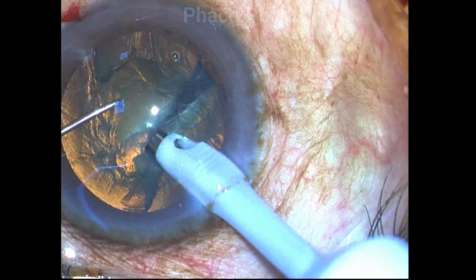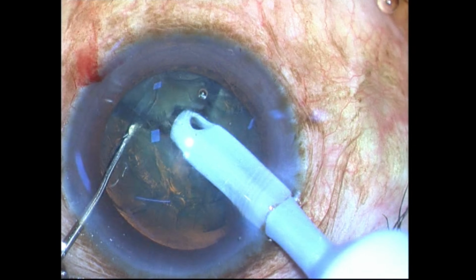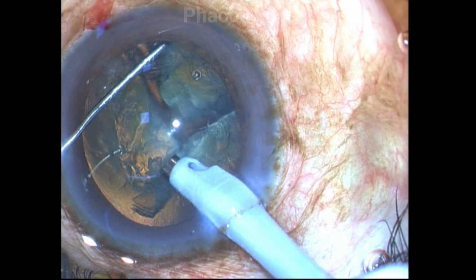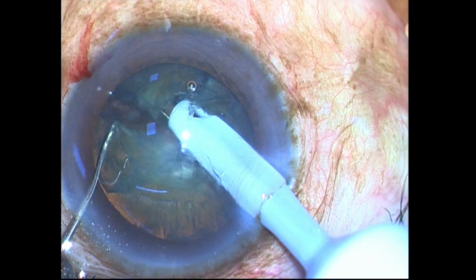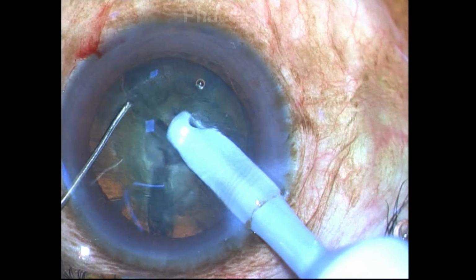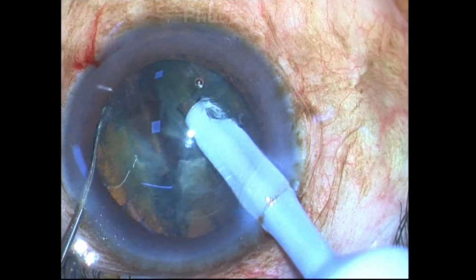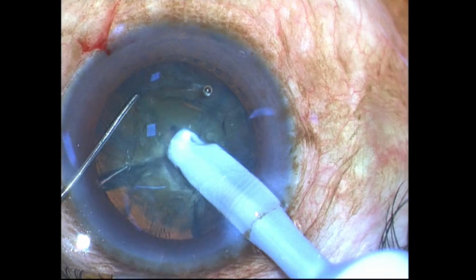The nucleus is then turned to facilitate the chop of the heminucleus, resulting in the nucleus now breaking up into 2 fragments. Now the nucleus is further rotated and this 1/4 of this fragment that seems quite big is chopped into 2 smaller fragments. Turn by turn in a sequential manner, each heminucleus is thereby further subdivided into emulsifiable fragments.